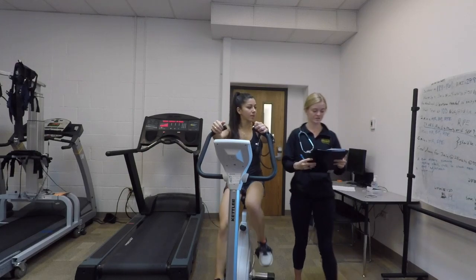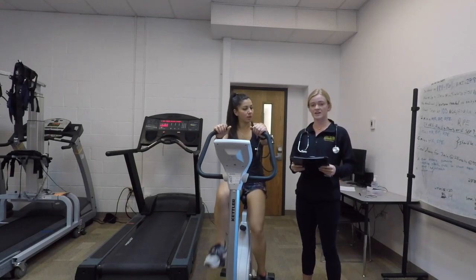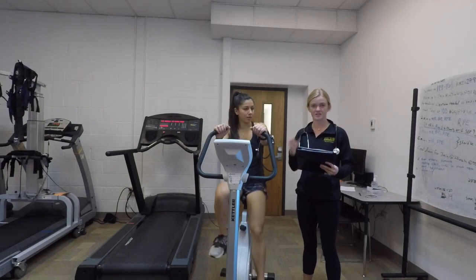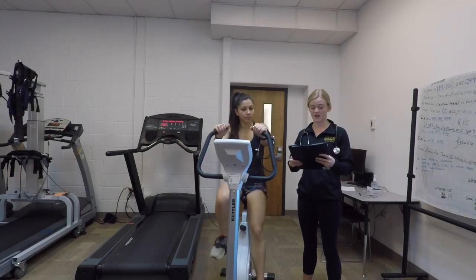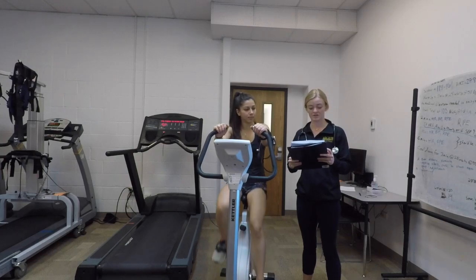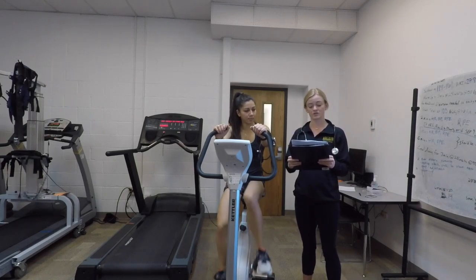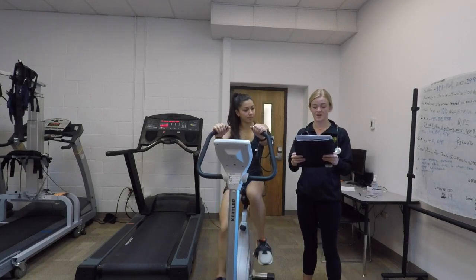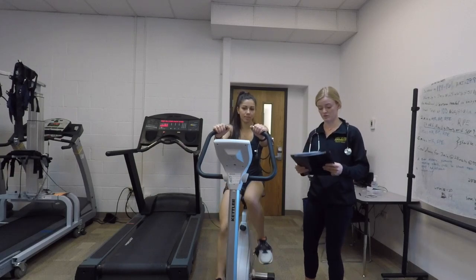Okay, I've taken her vitals, and she has a normal response to this dose of exercise, this increase. Her heart rate was at 84 beats per minute, and her blood pressure 116/70. Alyssa is a young, healthy female who exercises 5 days a week. She has no family history of cardiovascular disease and does not present any signs or symptoms of CV, metabolic, or renal disease. As a result, she has a low CV risk stratification according to ACSM. Medical clearance, therefore, is not necessary, and it is safe to continue with the test.